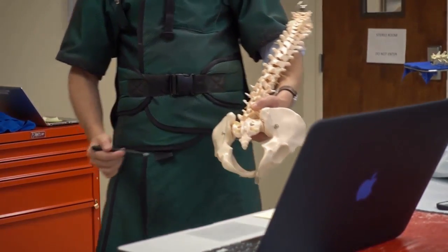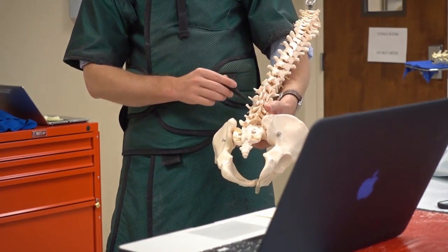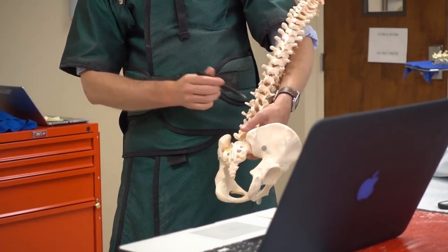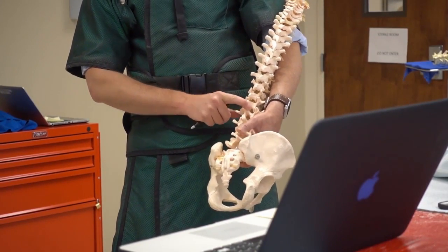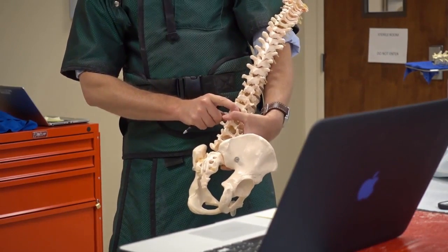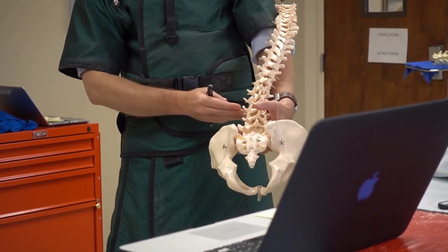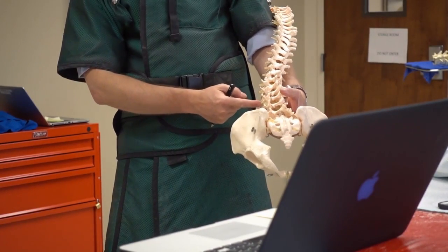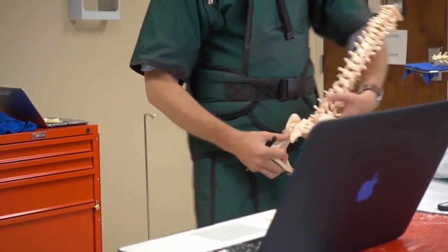So let's say you wanted to do an L2-3 interlaminar epidural, you'd have the spinous process of L3 and spinous process of L2 nice and sharp, right, because they're looking right at you. And you'd want the disc right here, so the inferior end plate of L2 and the superior end plate of L3 as crisp as possible. Let's just take a fluoro shot.